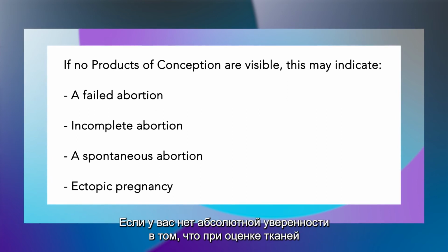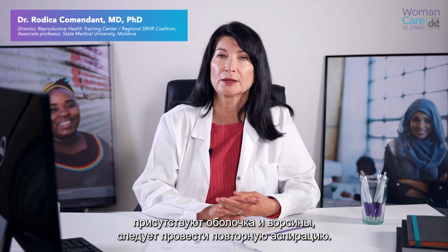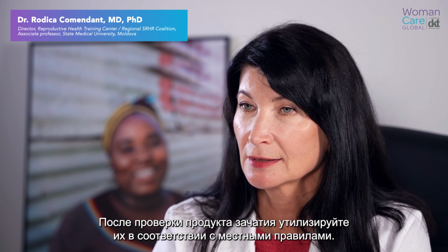If you are not absolutely sure that the sac and villi are present on tissue evaluation, reaspiration should be done. When the products of conception have been checked, dispose of them as per your local guidelines.